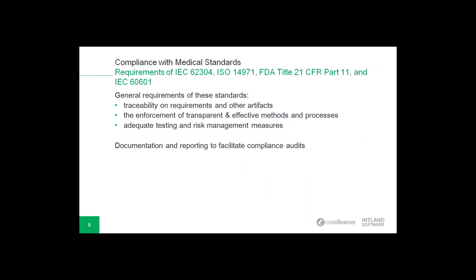So links will need to be established between the requirements and all other work items in order to ensure end-to-end traceability. Process visibility also needs to be ensured at all times. In other words, you will need to be able to present, preferably visualize, the processes that you are using in the development of software embedded in your medical devices. The high quality and reliability of these processes will also need to be ensured. For instance, you may have to use certain approval procedures or limit access to certain work items. Suitable quality assurance, risk management, and testing processes need to be used during development to ensure product quality as well.